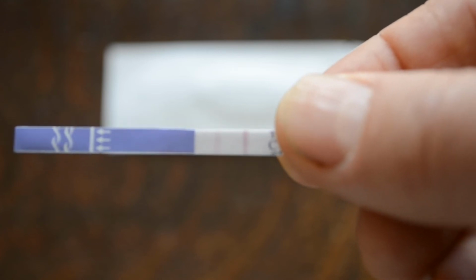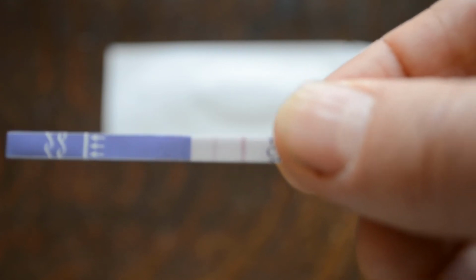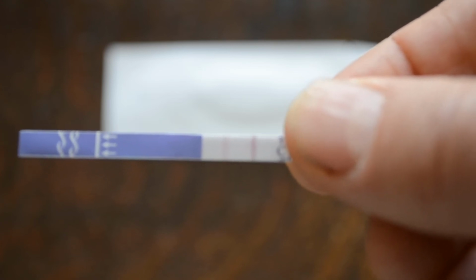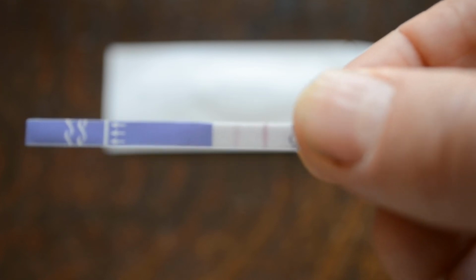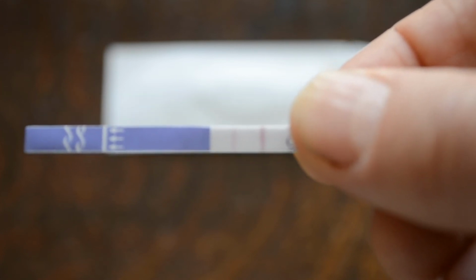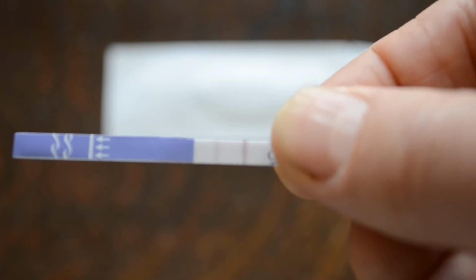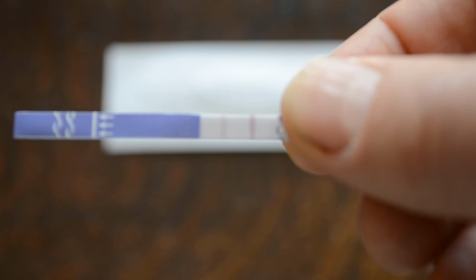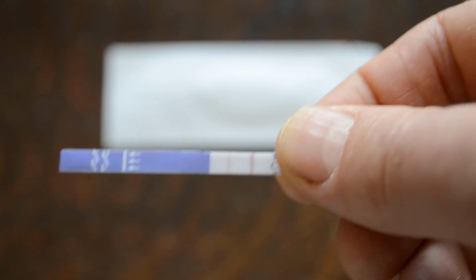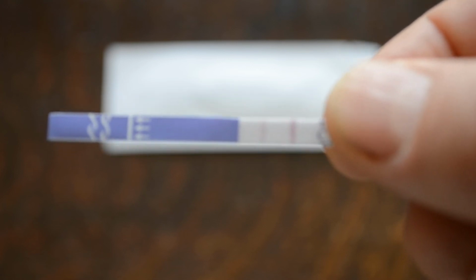Now, if there is drug in the sample, it will completely saturate the binding colloid at the membrane test area, and no test line will form over a 10-minute period. If there is no drug in the system, then the dye will form there and a test line will form. So a negative result is indicated by the presence of two lines, a test line in the presence of a control line.